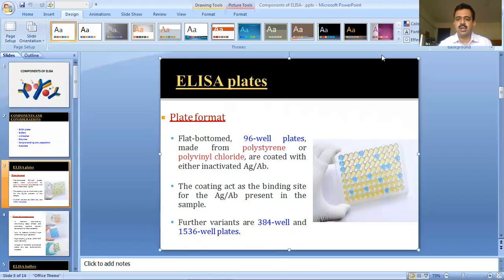So that's all for today. These are all the components that we have seen, and these components are helpful for the proper detection of a particular antigen present in the samples we have listed. The sample may be urine, a semen sample, or a blood sample as well, for detection of that particular antigen.